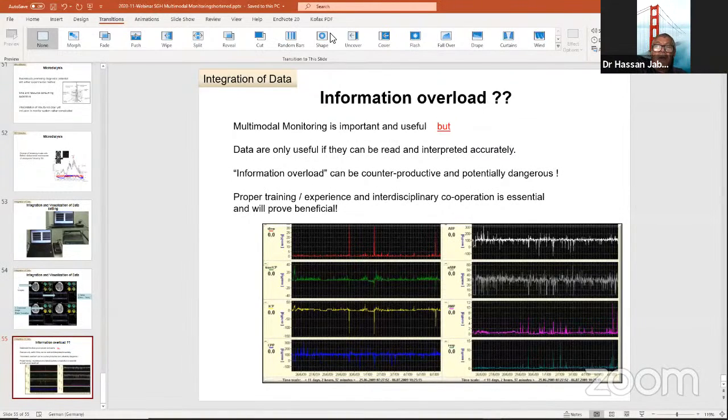Yeah, I agree with you. All this monitoring really made a difference. But I think one of the most important things to make a difference is the setup. If you have a neuro ICU, this will change the outcome altogether. Because with regular ICUs and monitors and ICPs, it will help, but you might not get the reading at the right time. So the whole purpose of having the ICP monitor is not there anymore, because by the time they read the ICP, they call you, and so there are delays. But if you have a neuro ICU, you'll have better outcomes, and you'll need all these gadgets.